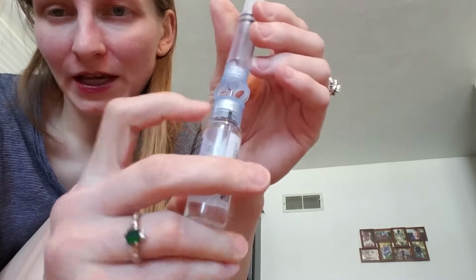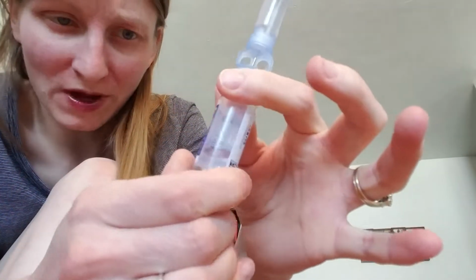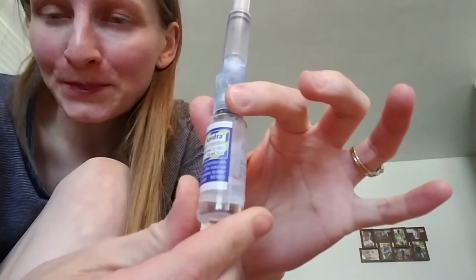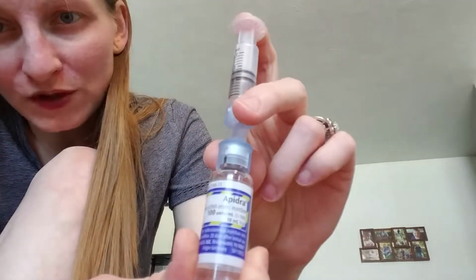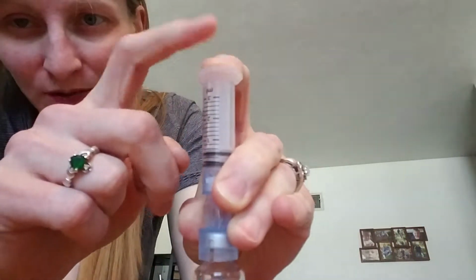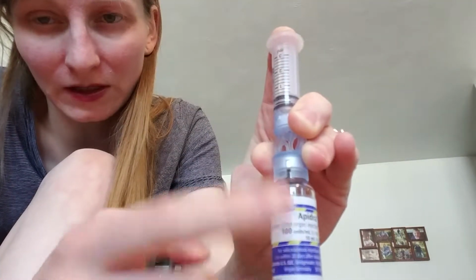That has a little needle on the end. Goes into the vial of insulin. So about 1,000 units, I believe, in each vial. So I can get 3 fills out of a bottle of insulin. I use something called Apidra insulin. I push the air into it while it's this way, and hold the plunger down firmly with my finger because it will start to suck itself. But at this point, it would be sucking air because the insulin isn't that high.